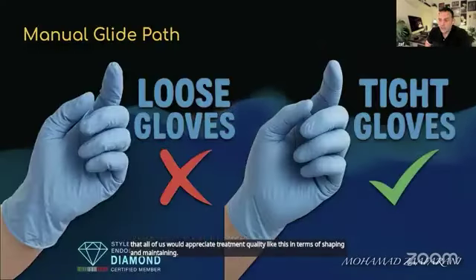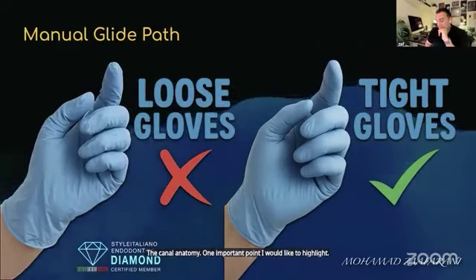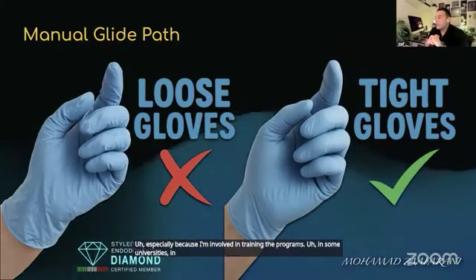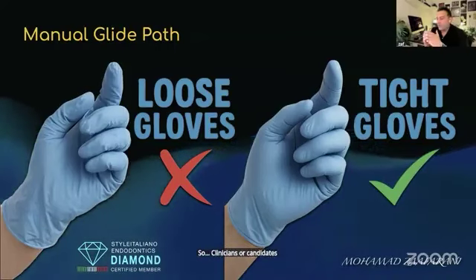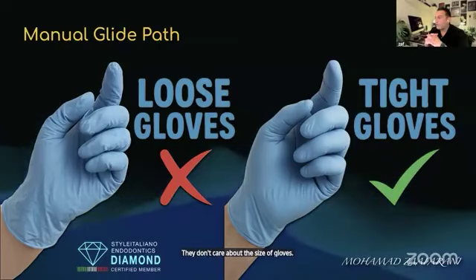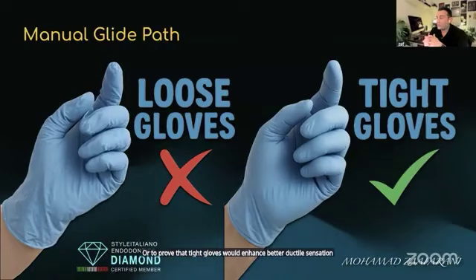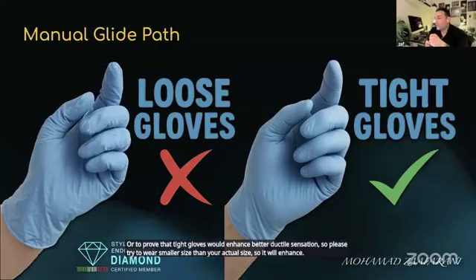One important point I would like to highlight, especially because I'm involved in training programs in some universities, in some courses: clinicians or candidates in their first trials don't care about the size of gloves. However, I would recommend, and can prove, that tight gloves enhance tactile sensation. So please try to wear a smaller size than your actual size, so it will enhance your tactile sensation.